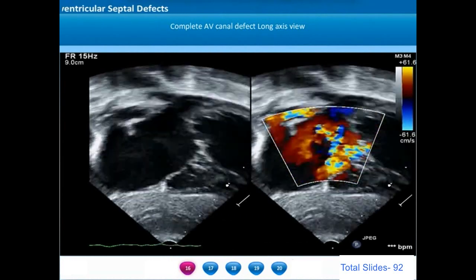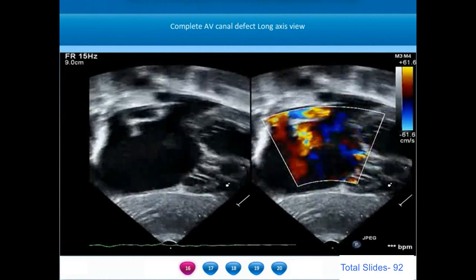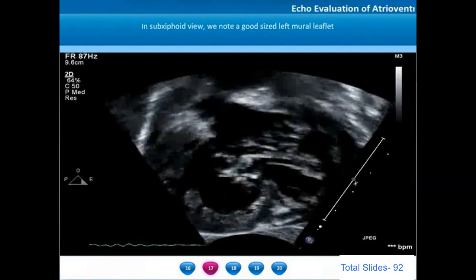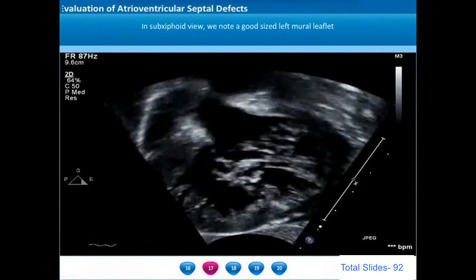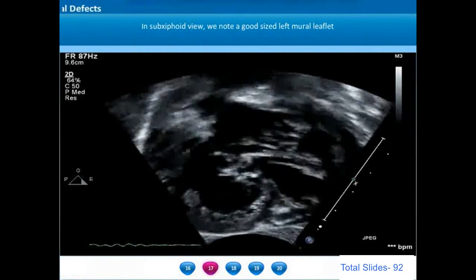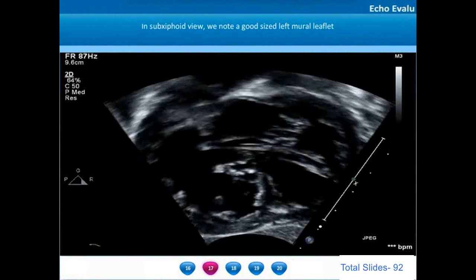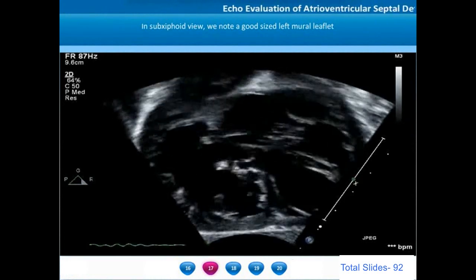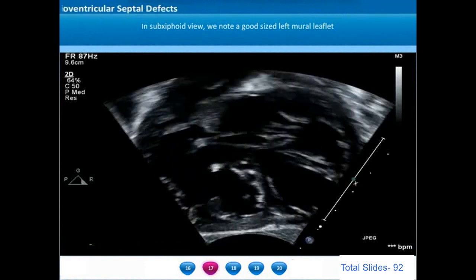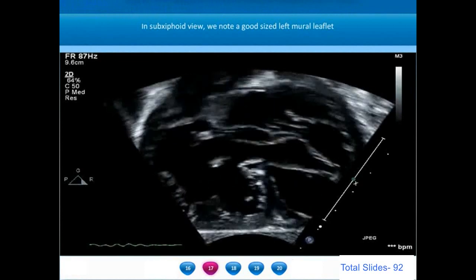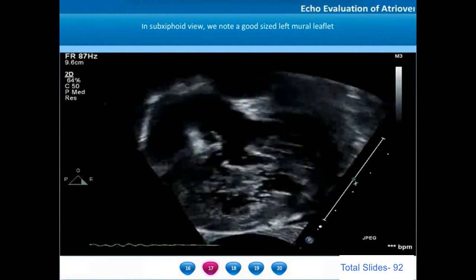On a subcostal long axis view, we can appreciate a large primum atrial septal defect and in addition there is a secundum atrial septal defect. On subcostal short axis view, analyzing all individual leaflets, we need to pay considerable attention to the left mural leaflet. A well-formed good-sized left mural leaflet located between the superior and inferior bridging leaflets is very important for long-term good results after AV septal defect repair.